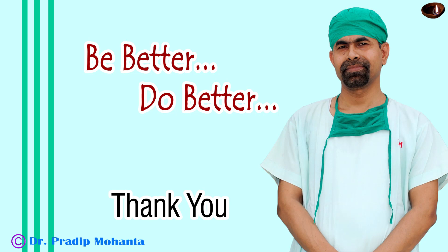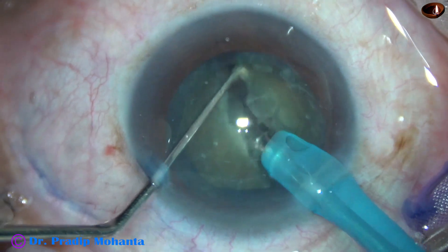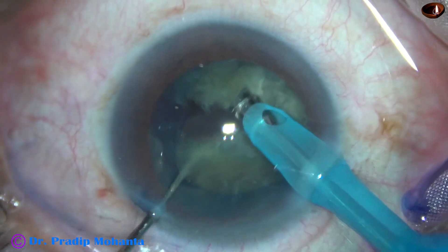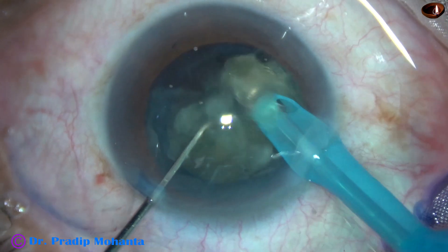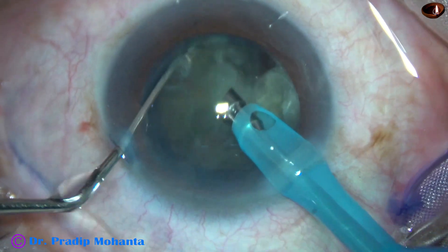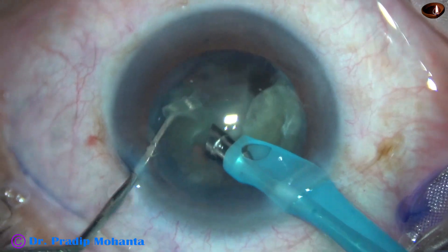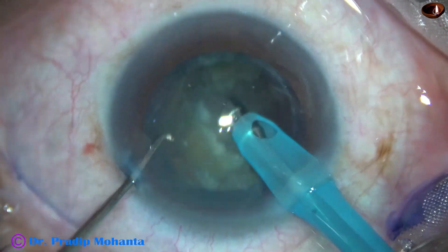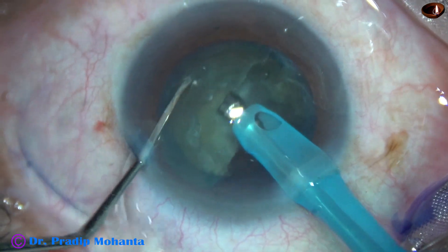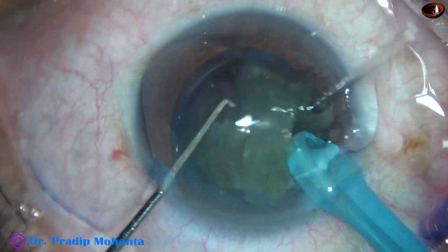Thank you very much for your attention. Hope this video will inspire you to do direct chop — no big deal. Just hold the nuclear mass very firmly at the central part in grade 3 cataracts and chop. Any chopper will do. You just have to hold the nuclear mass very firmly. Be a great surgeon and serve your patients with love, respect, compassion and great surgical competence. Keep going.